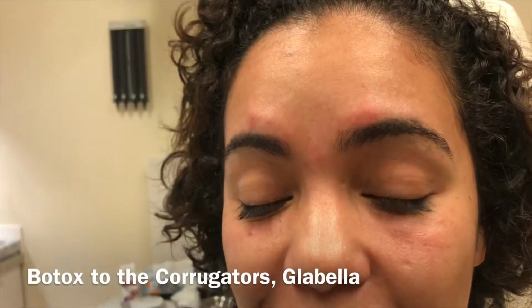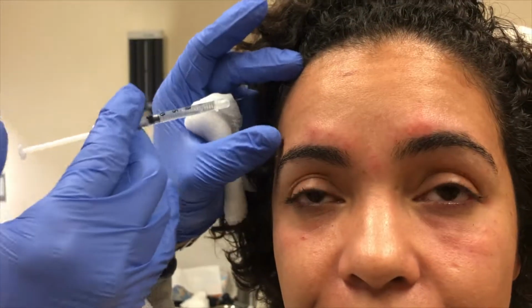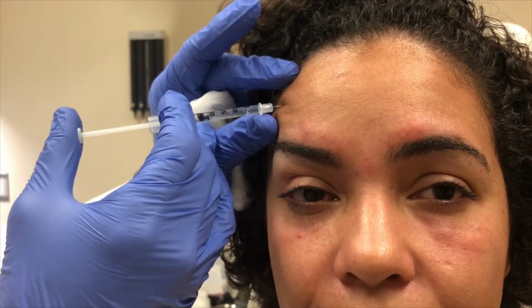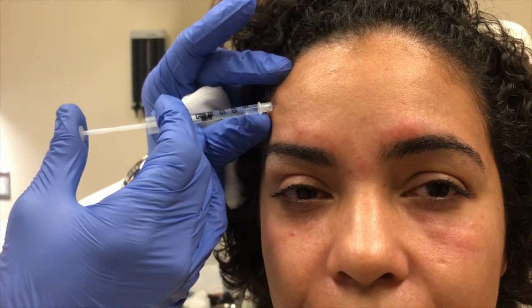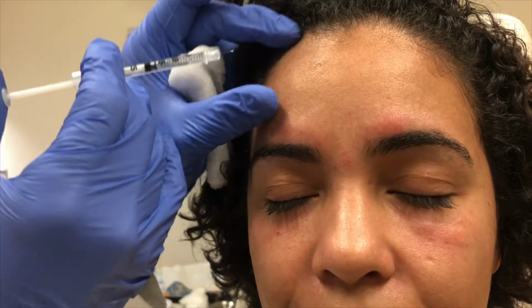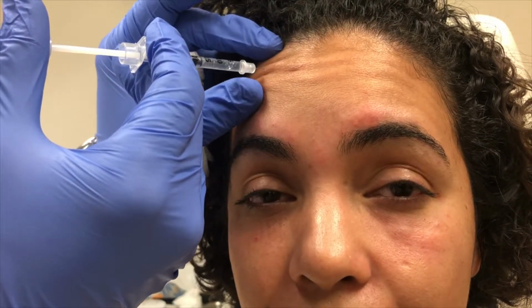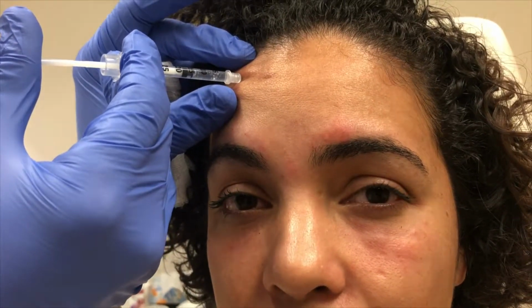Yeah. So raise your eyebrows for me again. Okay, so we're just going to follow the wrinkles here from right to left. And of course avoid any vessels. And then 1, 2, and 3 little pokes. All right. Doing great. Good. Raise your eyebrows again. Perfect. Right there. 1, 2, and there's 3. Good. Wonderful.